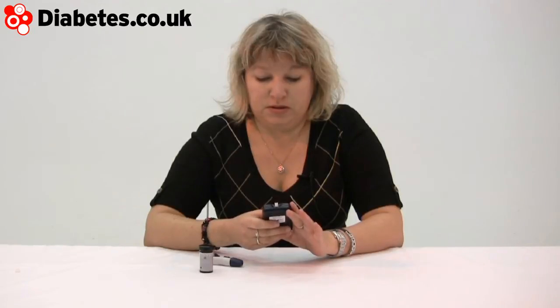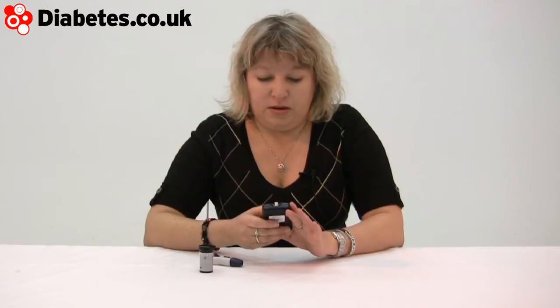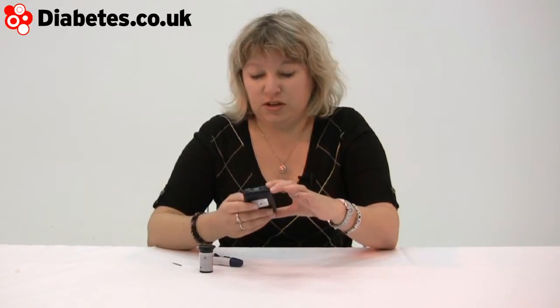I'm going to scroll down and say no — as it happens, it's mid-morning and it's not after a meal. Then you can display the results: either just the last result, all results, or averages. You can also go in and adjust the settings. Given time, once you've built up enough results, you can start to see patterns, and that can be extremely helpful when you're controlling your diabetes.